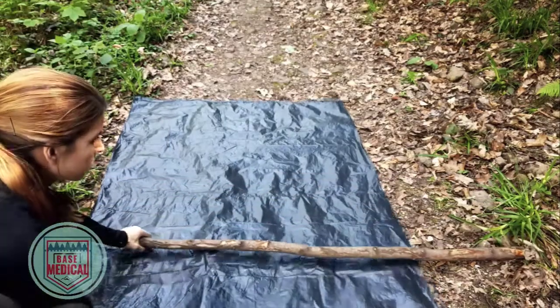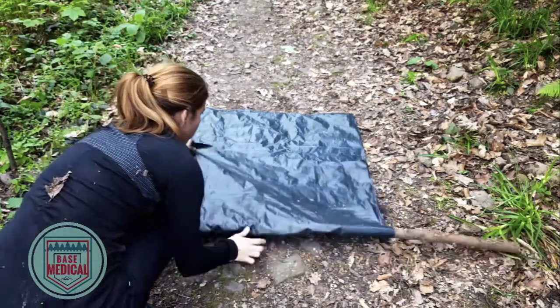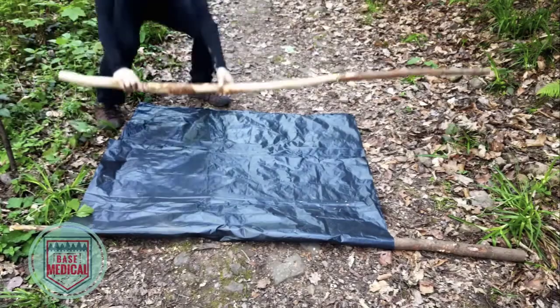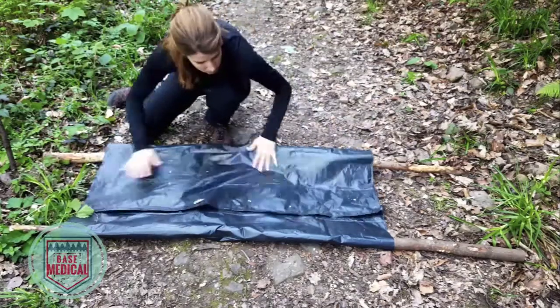Lay the tarp flat. Place a pole or branch at the one-third position and fold that one-third section over the pole. Place the other pole on top, then fold the remaining one-third over this pole. The weight of your patient should hold the tarp in place.